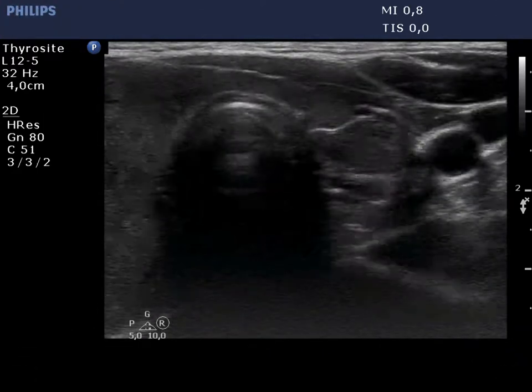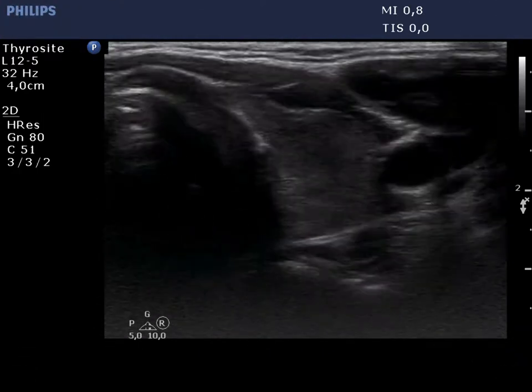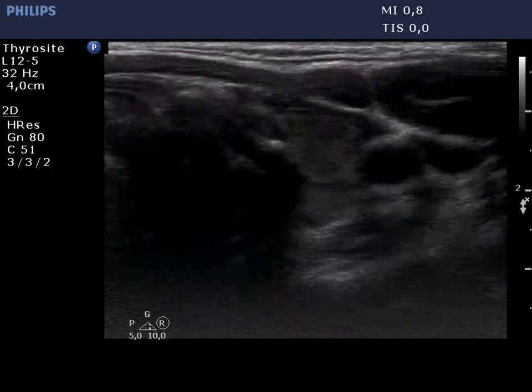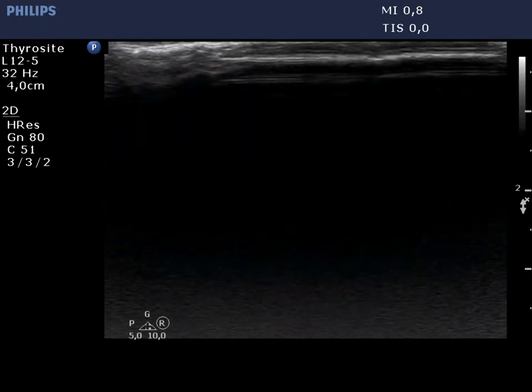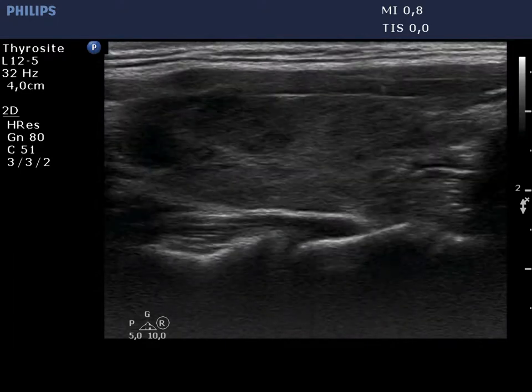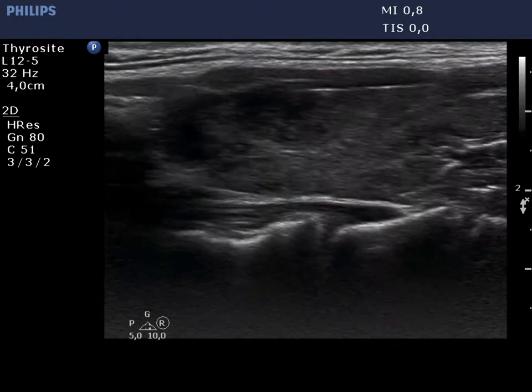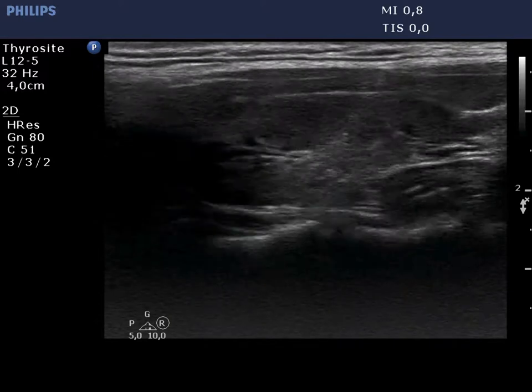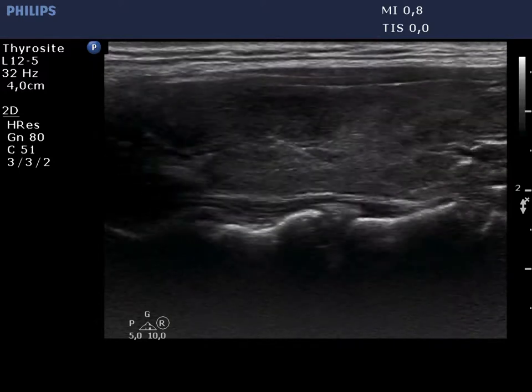The left lobe is moderately hypoechoic. There are several more hypoechoic areas within. These areas have irregular shape and borders.